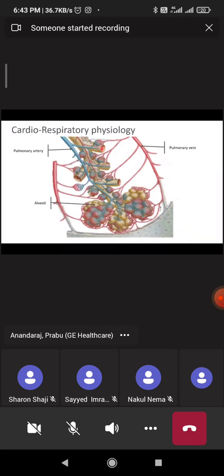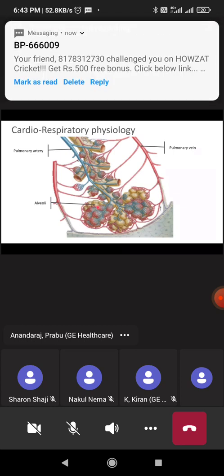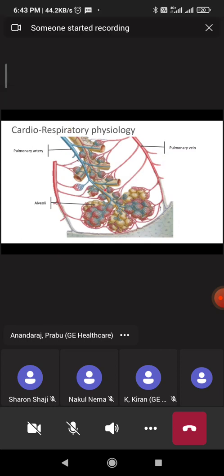So now what happens? During the last few milliseconds of the gas escaping out, the diameter would have been very small here. As a result, the resistance would have increased a lot. As expiration is passive, you need to allow a longer time for the gas to go out. If you don't allow adequate time for this pressure or volume to escape out, before the tidal volume is emptied, the next breath will start and it will bring additional gas. So this will become a vicious cycle.